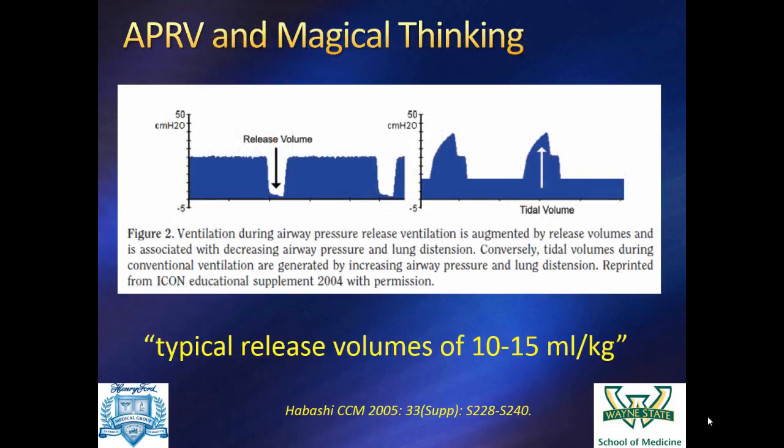And then this is the part that really drives me crazy. If I showed you a graph like this and said, oh, I have a patient with ARDS, and I put them on a tidal volume of 10 to 15 milliliters per kilo, you'd say, oh my God, don't you read the literature? You can't do that.